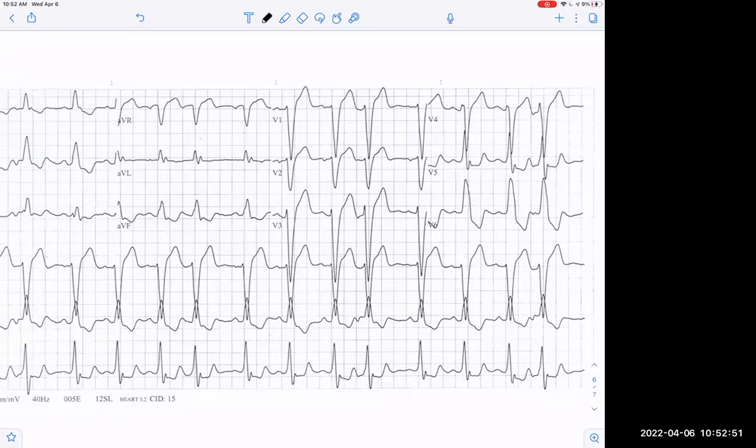Again, it's much better to treat something like a STEMI and it not be a STEMI than to not treat something like a STEMI and it's an actual STEMI. Okay, gotcha, thank you. Absolutely. All right, so this next practice 12 lead, what are we looking at here?